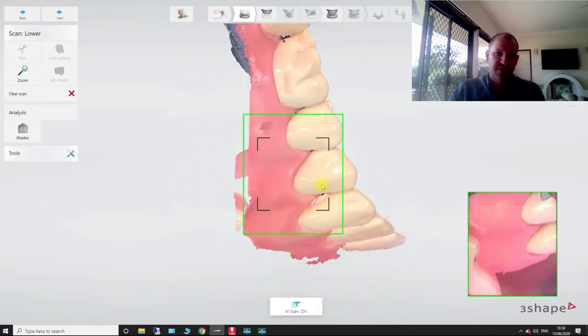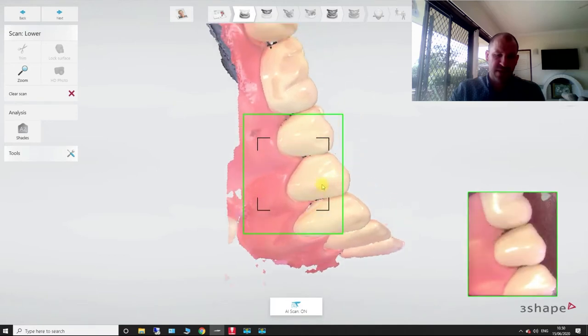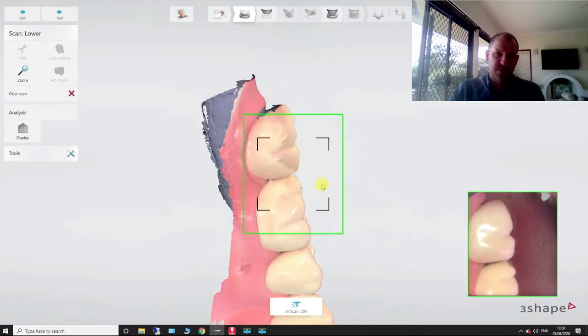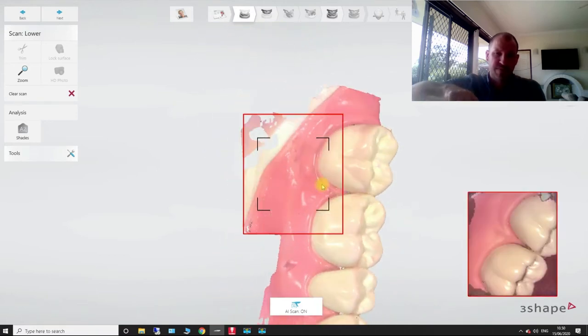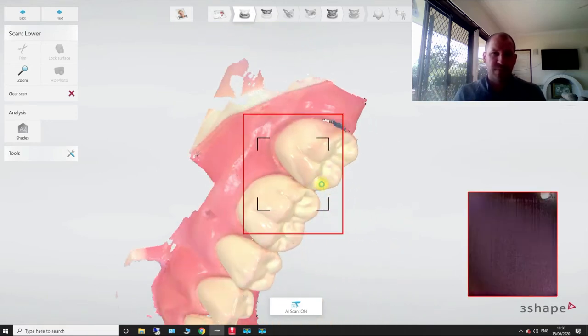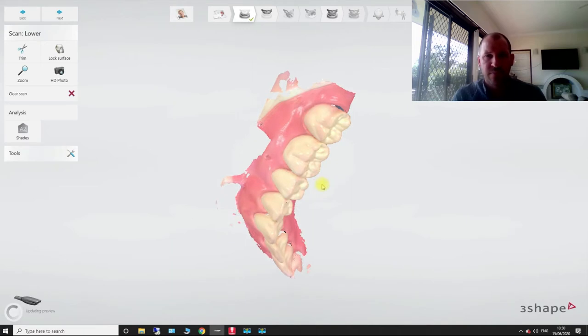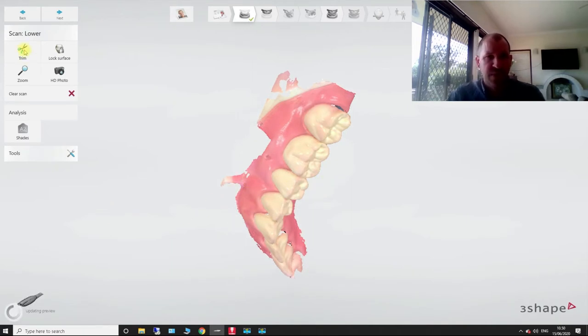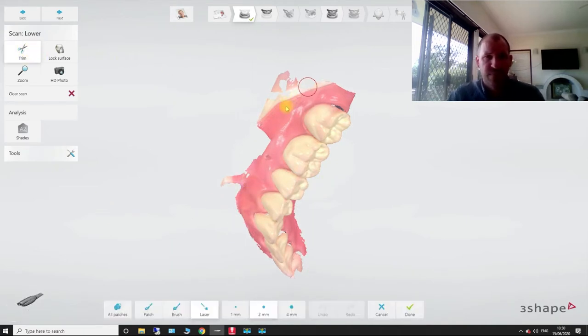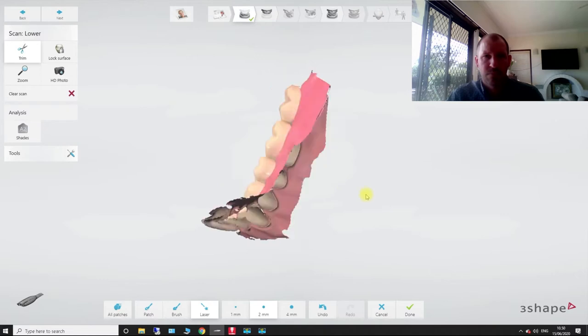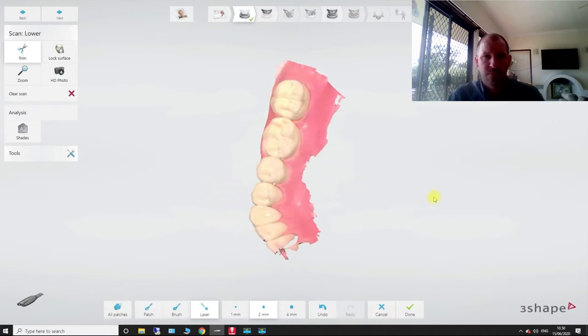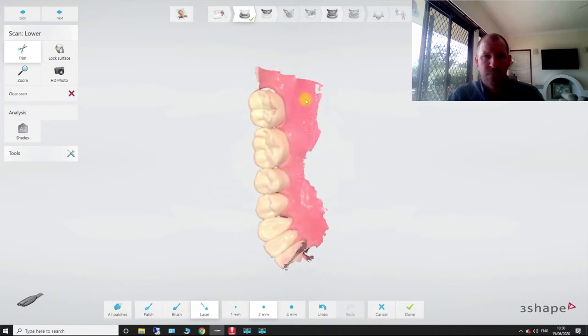So we're going to scan our lower. So after our lower scan, I'm just picking up some of the interproximal areas here. Let's just do a quick trim.